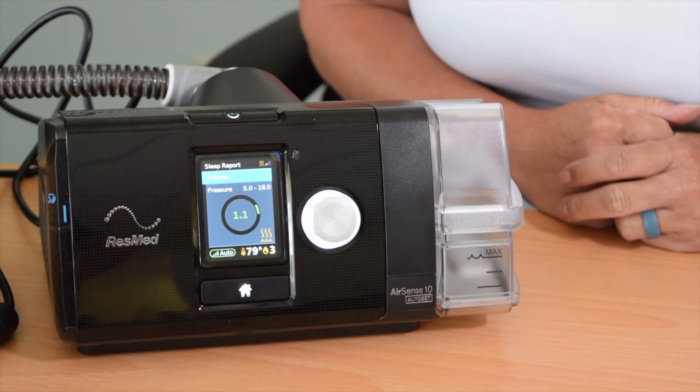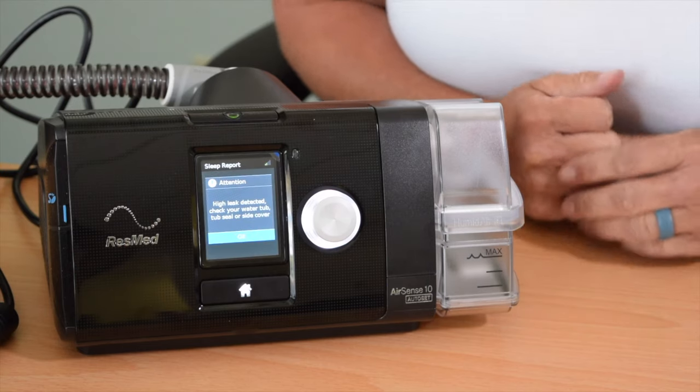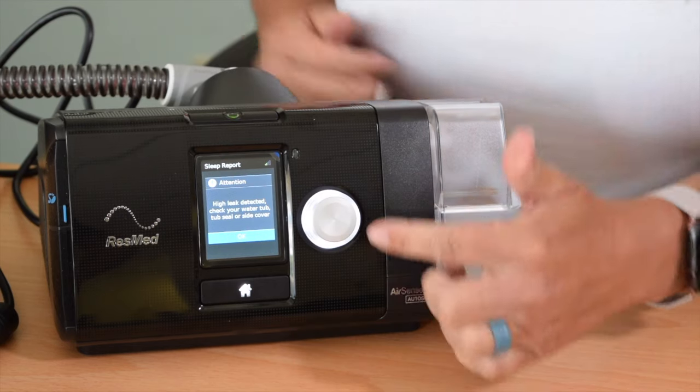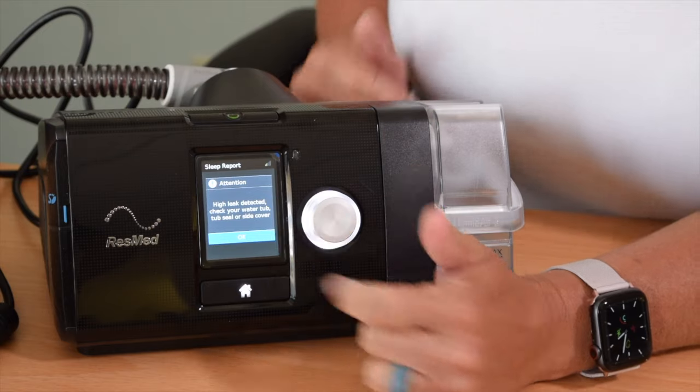Number two issue is the water chamber. Sometimes it can be tricky — especially if you have any issues with your hands — to get that water chamber seated just right. If it's not in all the way and you go to start your therapy, you're going to hear a very large leak, and in just a moment the machine is going to stop. It's going to give you an attention message on the front of your screen and the button up here will be blinking.